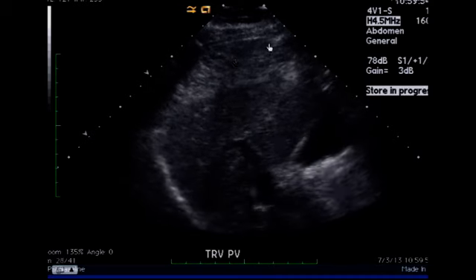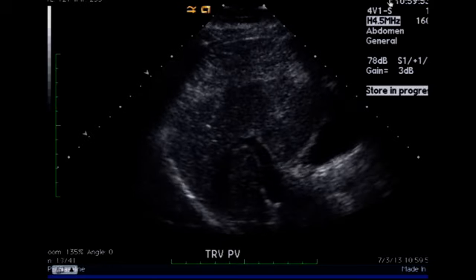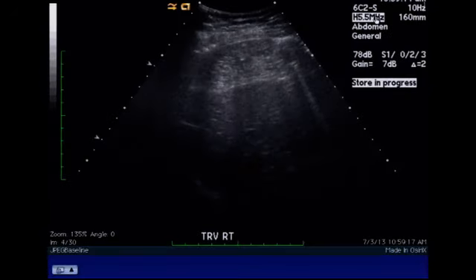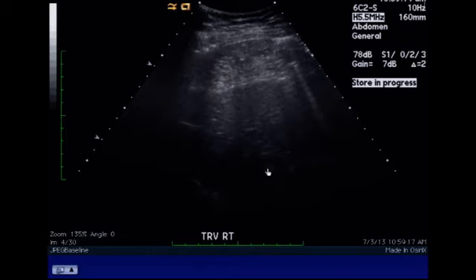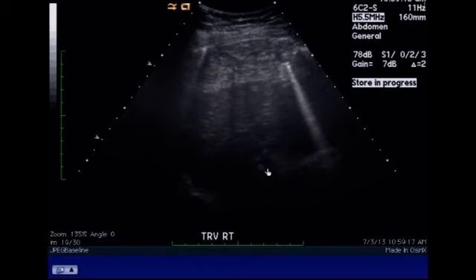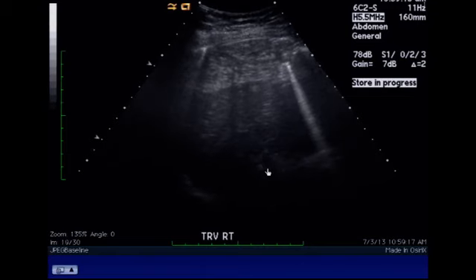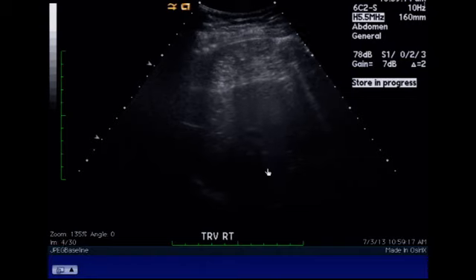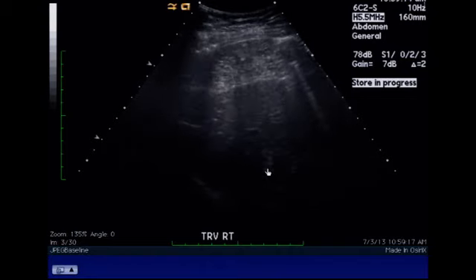Again, an abundant amount of fat around the liver made the imaging a little suboptimal, and this was using a 4 megahertz transducer. If we switch to a higher frequency transducer, we can see these bubbles really jump right out at us. Now that we're considering using contrast-enhanced ultrasound, it's known that if you image microbubbles with a higher frequency transducer, it'll make them much more conspicuous.